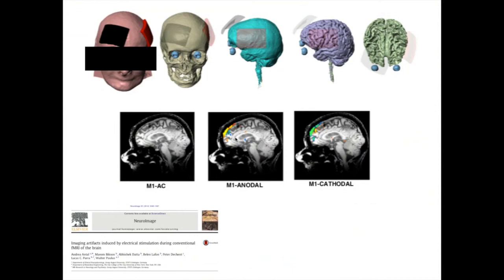We've certainly worked with other groups around the world to try altering various aspects of their setup, and have been successful in reducing the artifacts they're seeing. So they're not impossible to get rid of. They're just a little bit tricky and a bit non-linear. Again, we're very happy, as I'm sure other people are, to try and help with that. But it's something to look at very, very carefully before you start actually acquiring data.